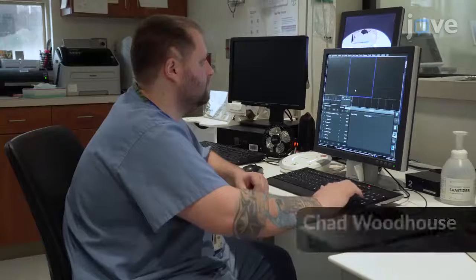Demonstrating the cardiac MRI exam with me will be Deb Brannon, our lead MRI technologist, and Chad Woodhouse, a cardiac MRI technologist.